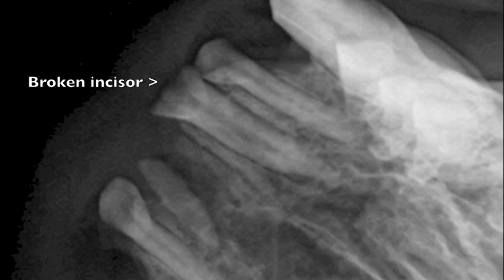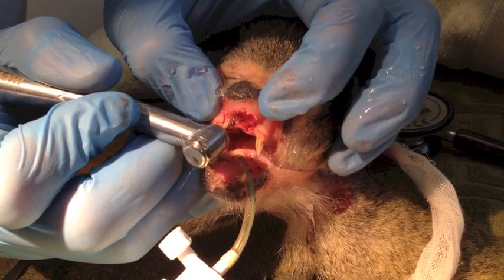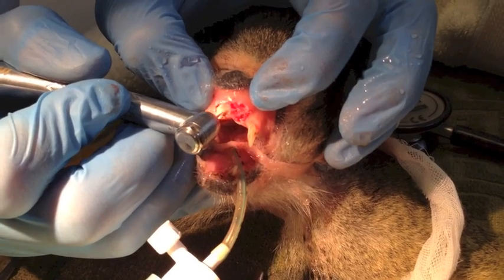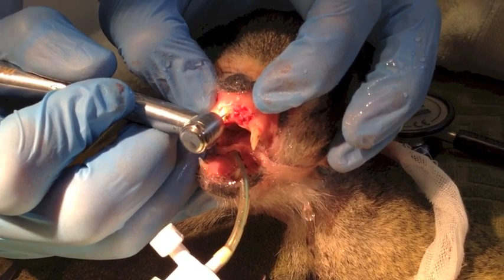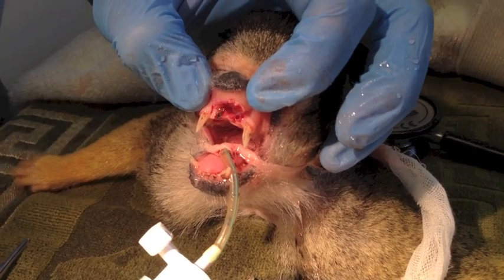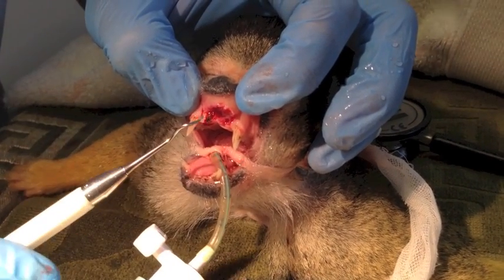If you're a dentist watching this, or you've a keen eye, you might be thinking, hey, what about that discoloured broken incisor next door? Well, we haven't forgotten about that. This, if left, would lead to a problem very similar to the one that we've just seen. So we're removing this in the same dental operation. This is going to be a bit more of a solid tooth and will take some drilling out. The bone around the root drilled away, we now need to break down the soft tissue.